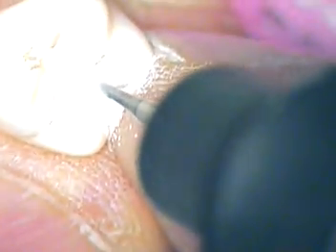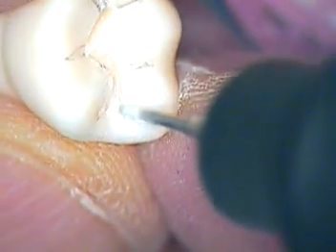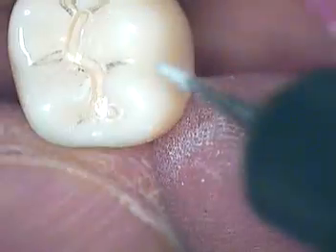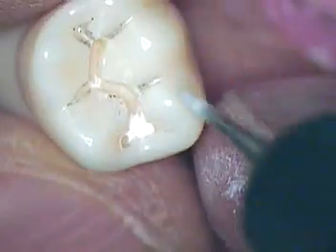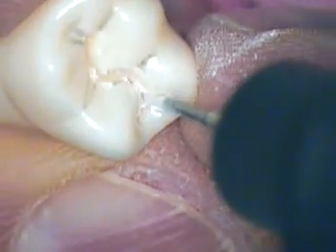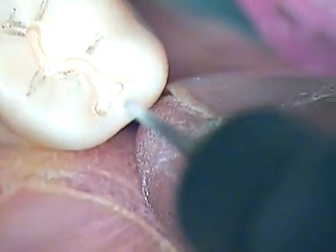Now don't forget, this is a tapered bur, so try to make sure you maintain — lock your wrists and fingers. Now I'm going to develop the dovetail. You don't want to deviate. Just pull it, let the bur do the cutting. Maybe a little bit more buccally. That's my distal dovetail finished.